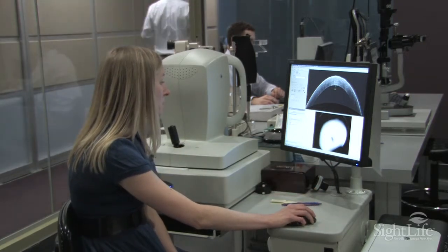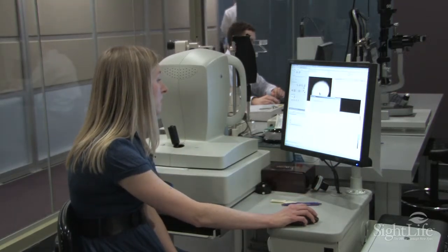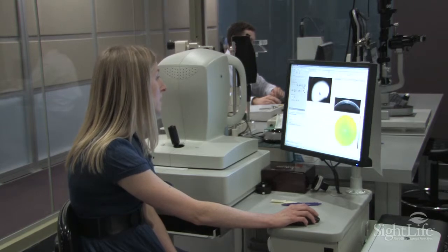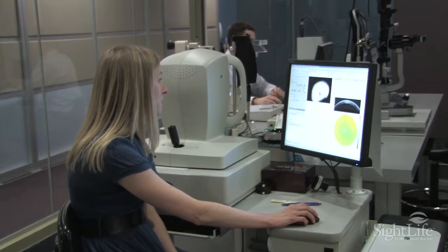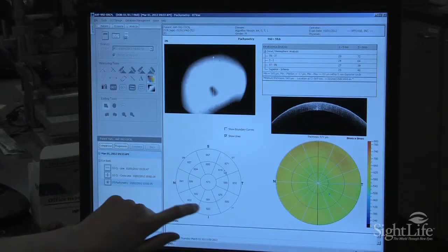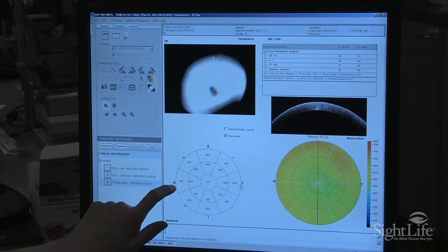We can actually look at an entire map of the cornea, and that's right here. Within each quadrant you can see how thick on average the cornea is.